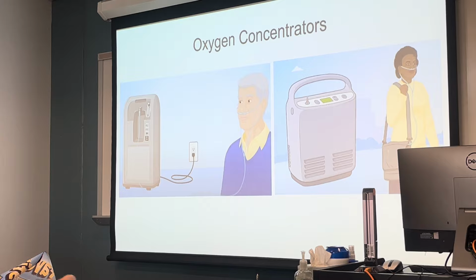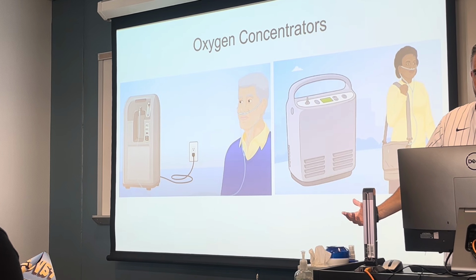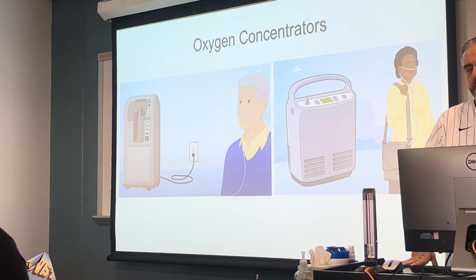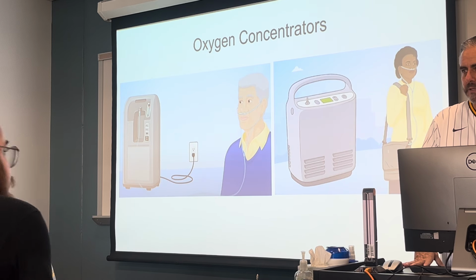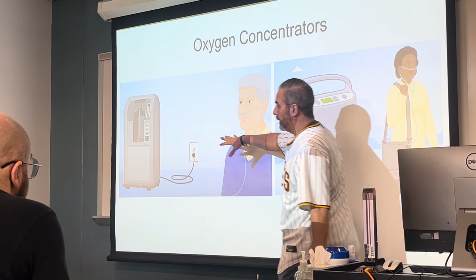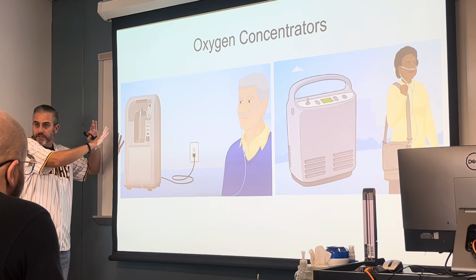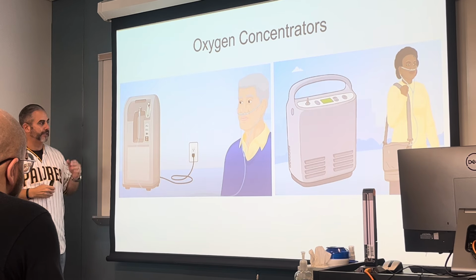You may see something like this outside of the hospital setting. So an oxygen concentrator does require electricity to work, does require a power source, so it does have to be plugged into electricity. This will pull in regular atmospheric air, filtering out the nitrogen and all the other gases, leaving nothing but oxygen.